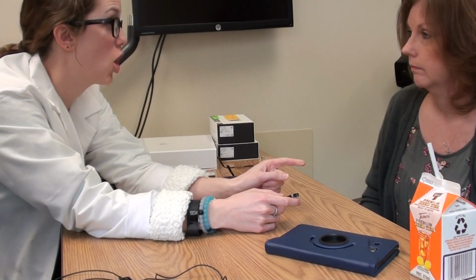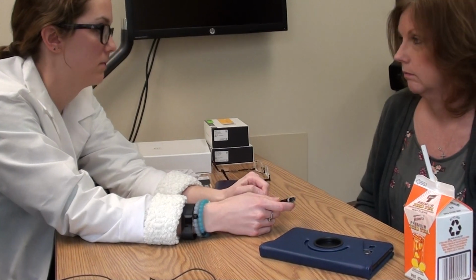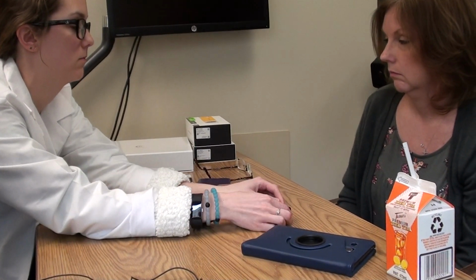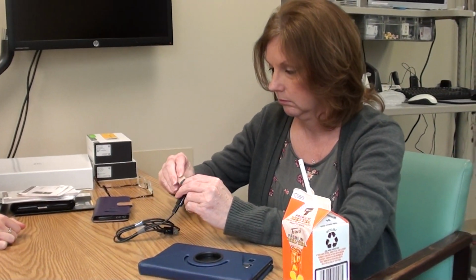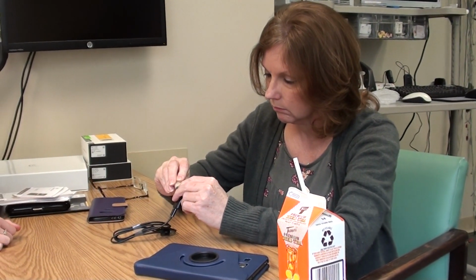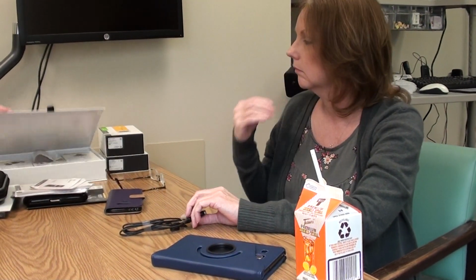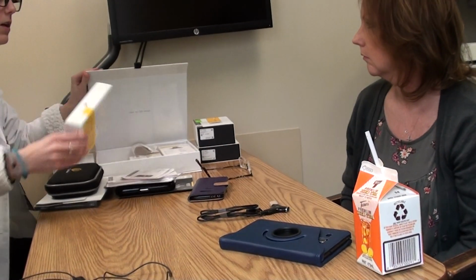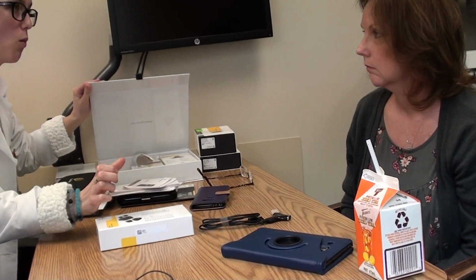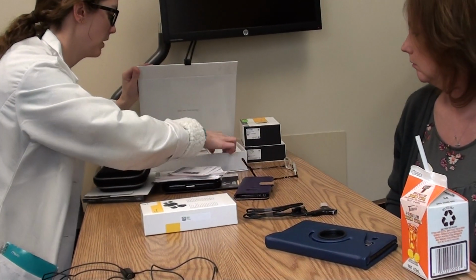Okay. And when it's charging, this will flash green. Okay. So go ahead, put that on there. Good. Perfect. This is the plug for the wall, or it has the USB.